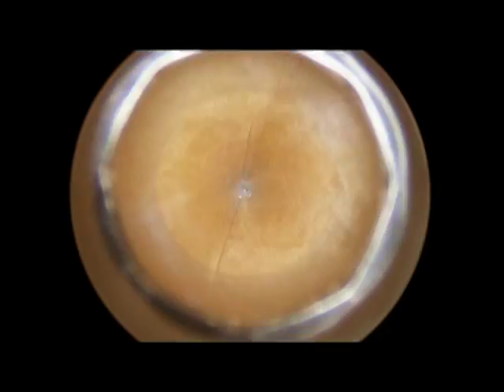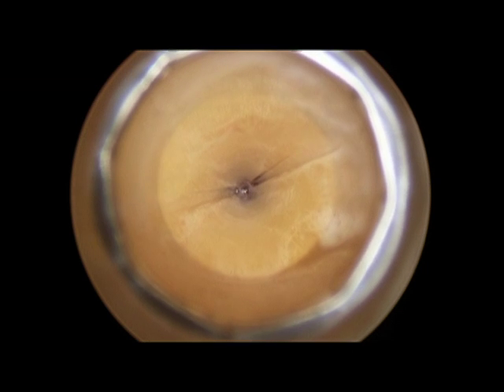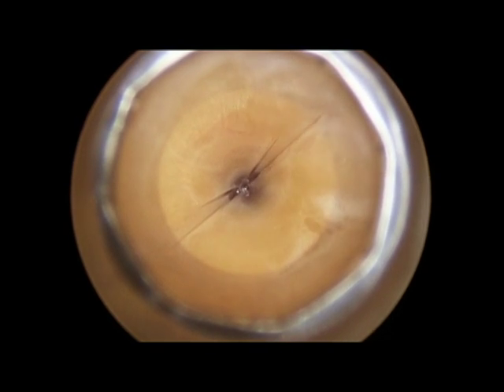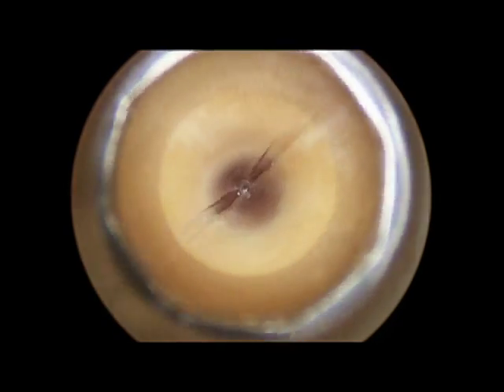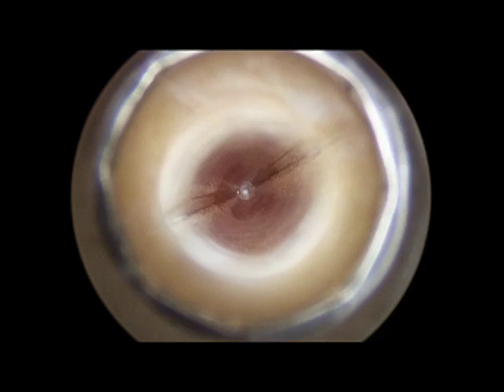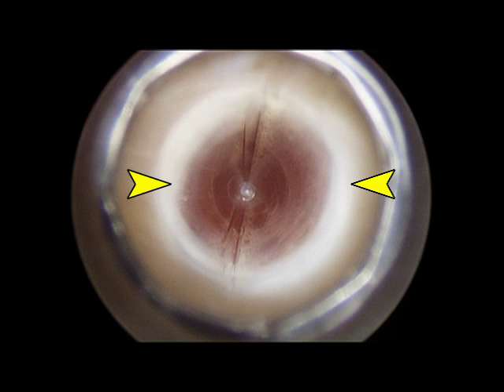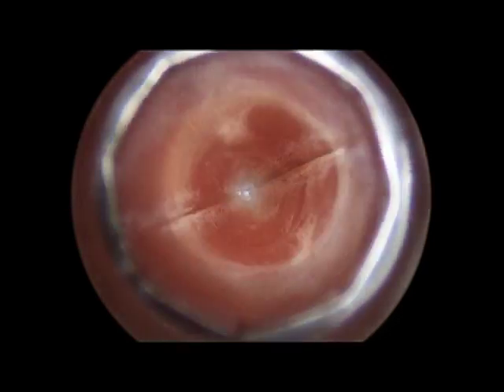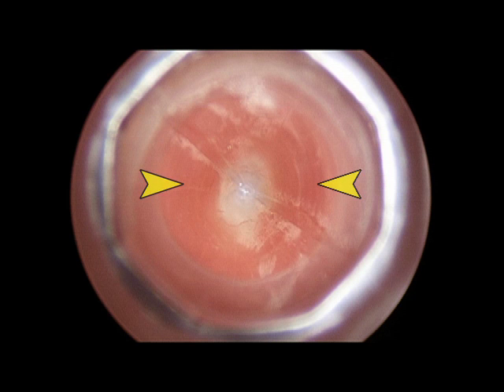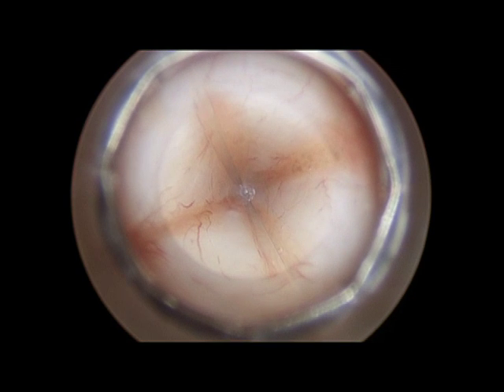This video shows the trocar being introduced through these layers under direct vision. A small skin incision has been made and the trocar is introduced into the subcutaneous fat. As it is advanced, the white anterior rectus sheath is clearly seen. Next, the rectus muscle is spread. The posterior sheath is again easy to distinguish.